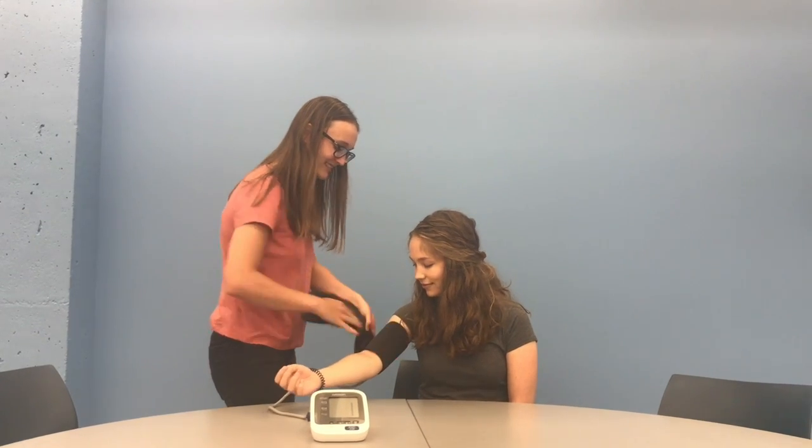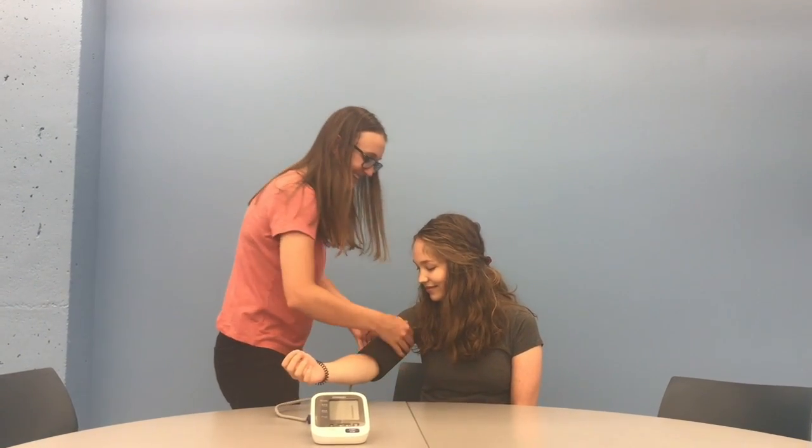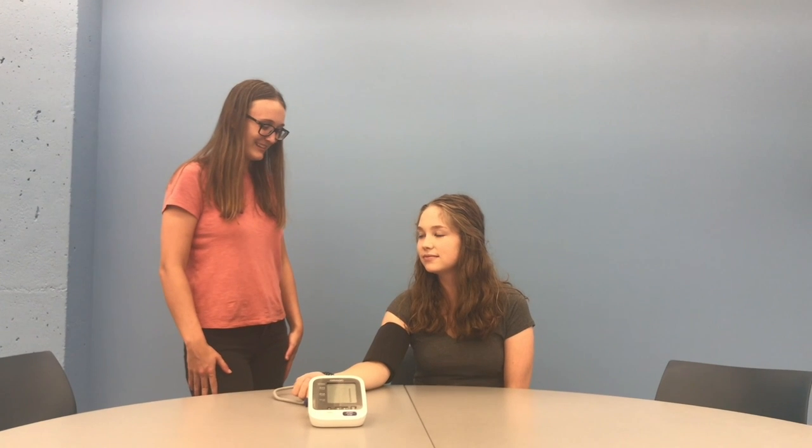Make sure the chair has a comfortable and supportive back so that the participant can relax the neck and shoulder muscles as much as possible. Start recording the time and allow a 5-minute waiting period where the participant remains sitting before taking the blood pressure.